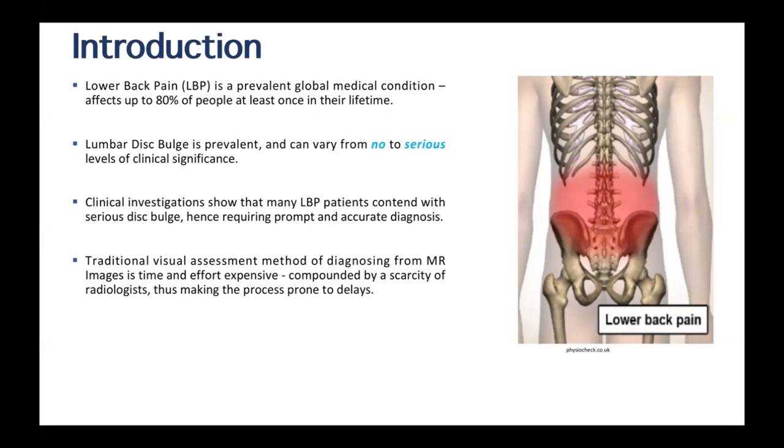So you get an MRI scan, then you have to book an appointment to see a radiologist to interpret or diagnose the MRI. This is quite effort expensive, right? With the limited number of radiologists we have, and also the delays, especially with the NHS, if you're familiar with the UK, this is also time consuming.